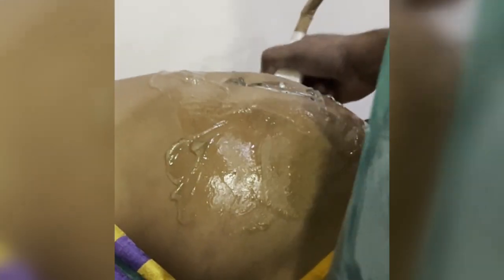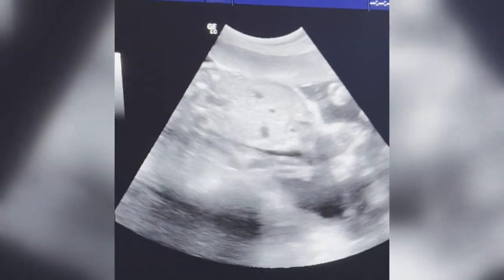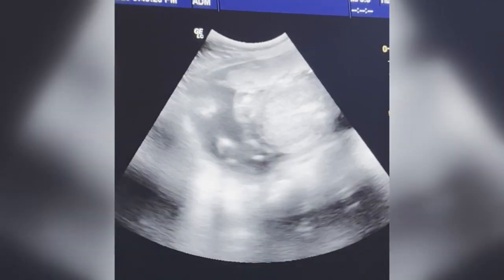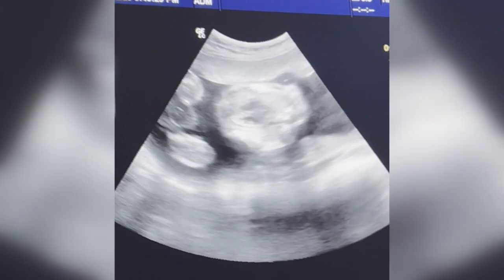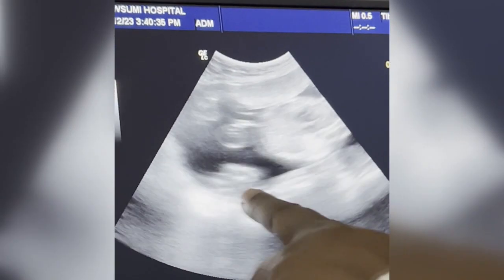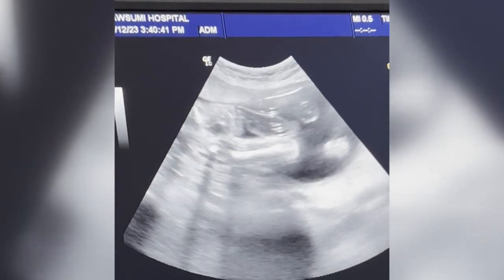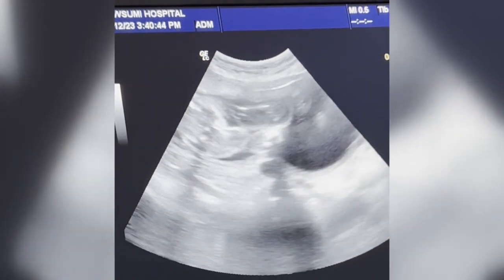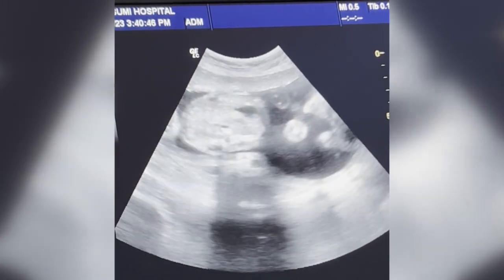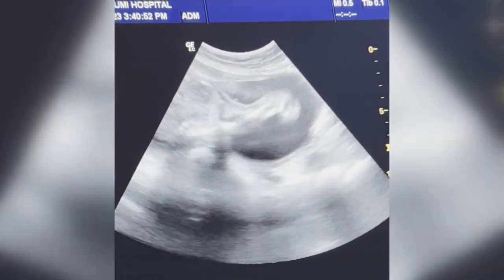Now I shall go for leg. Leg should be in the opposite side. So I have come. See the bones. I shall rotate the probe. You are seeing the legs. It is the leg and leg bone. It is the femur. Nicely displayed femur. The baby is moving. Baby is alive and it is moving.